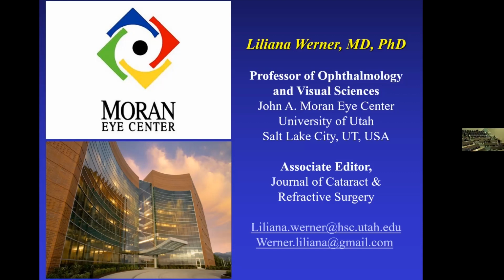Oh, yeah. Nowadays, I would say the hydrophobic acrylic materials are likely the most popular. And you have a choice among different hydrophobic acrylic materials that do not have glistenings as an issue. So you have great choices, and single piece lenses are, of course, one of the preferred nowadays also, if you consider popularity. But you have to know that they are not so good for the sulcus. So you have to take all of those things into consideration.